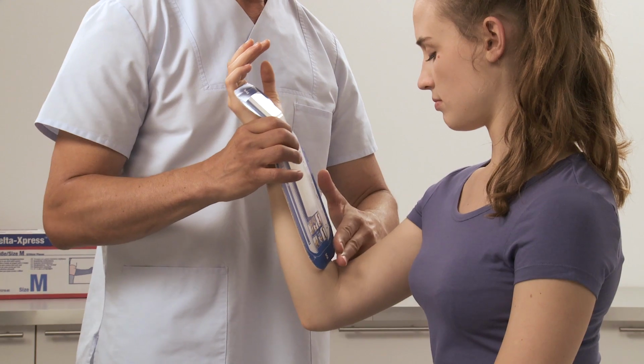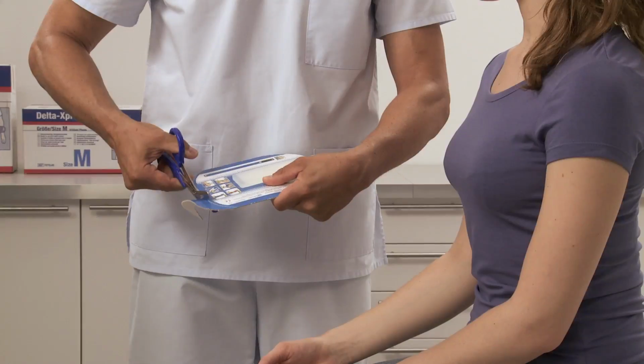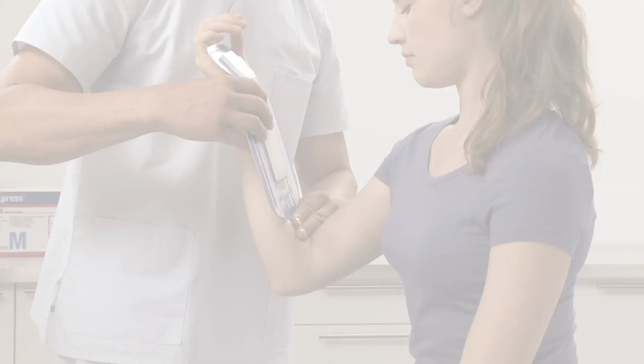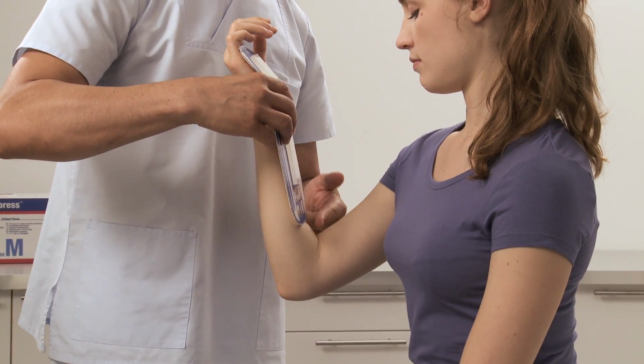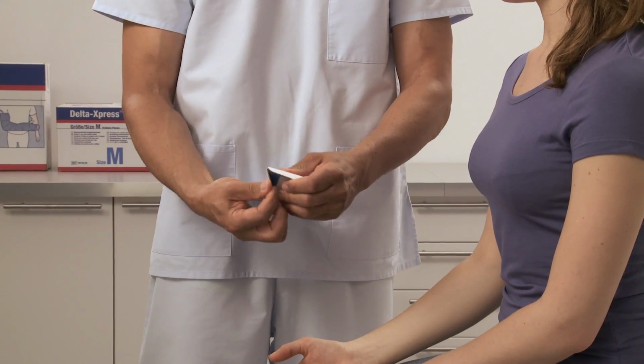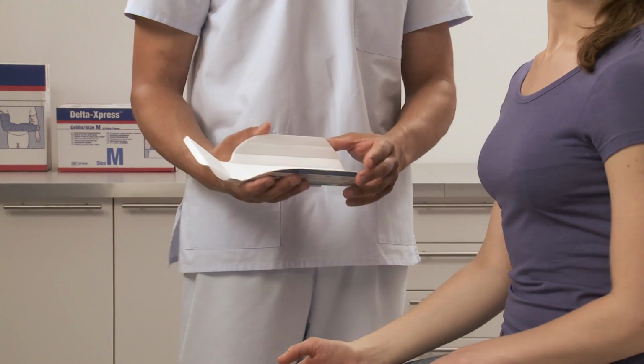Check the length by holding it in the intended final position, where the forearm and the carpals have full contact with the splint. If necessary, trim the proximal side. With a 90-degree flex in the elbow, the space between the splint's proximal end and the elbow crease should be 2 fingers wide. Position the Delta-Xpress splint onto the limb.